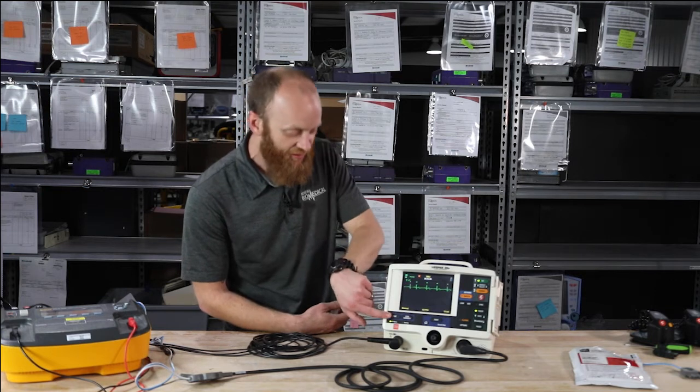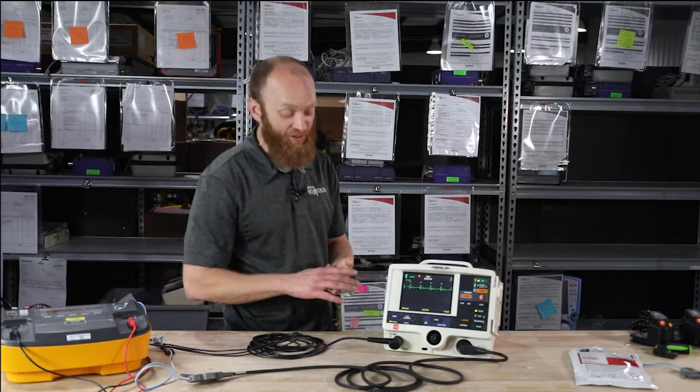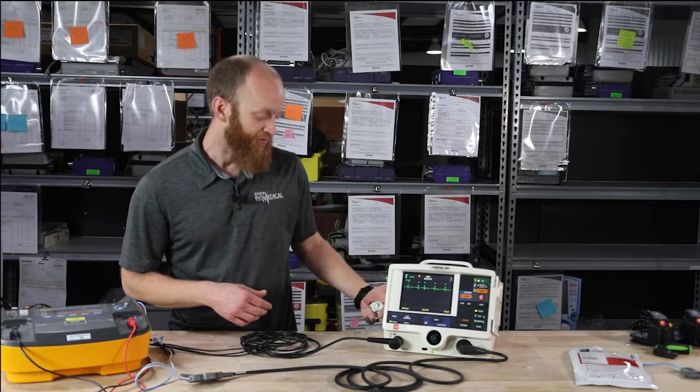Hit the print button to stop the paper, or if you want to start the paper, hit print and it will start printing what's on the monitoring screen.